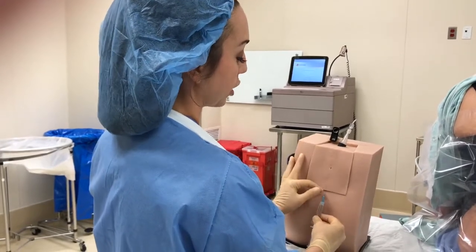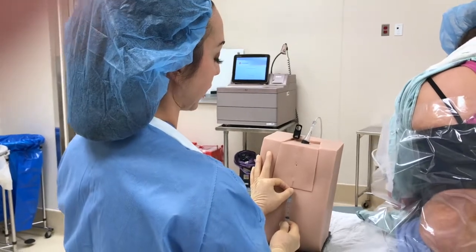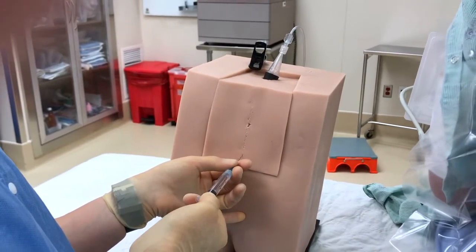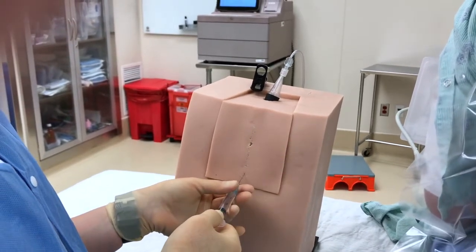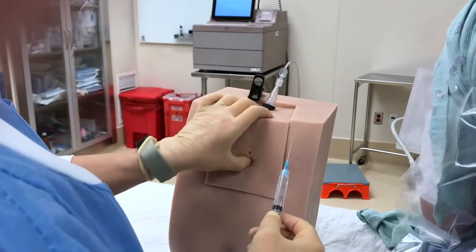So some people like to start from here and superficially inject. I'm not sure if you can see it on the mannequin or not. Some people like to go directly perpendicular, and when you're just right at the surface of the skin, you can inject and create a little local wheal. However you choose to do it, you should see a nice bubble in the skin, and that will be your skin wheal. And then I'll go up to the correct space.